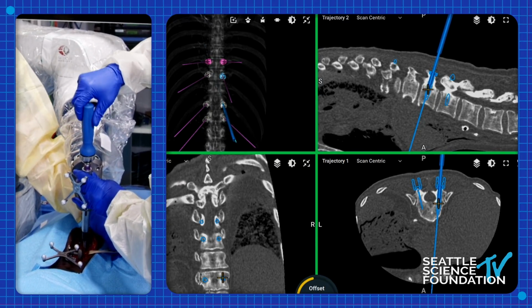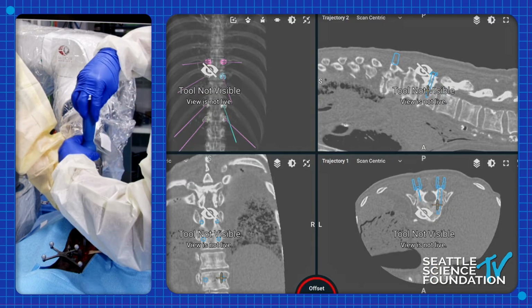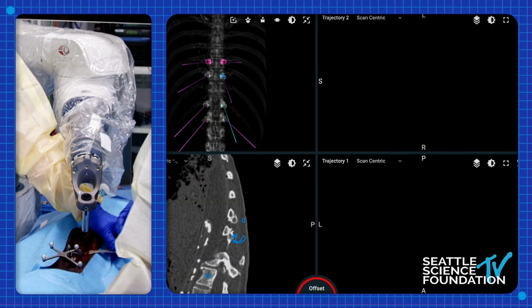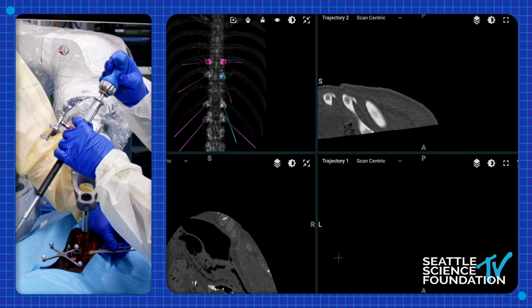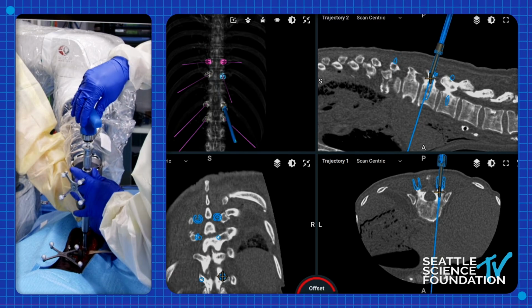So I actually hand place almost all my screws regardless. I think at some point I'll probably develop carpal tunnel or maybe some CMC arthritis that'll make me switch over to power. But right now I do appreciate, and it gives me a better feel of the quality of the bone when I can feel the engagement. So I do appreciate the feel.